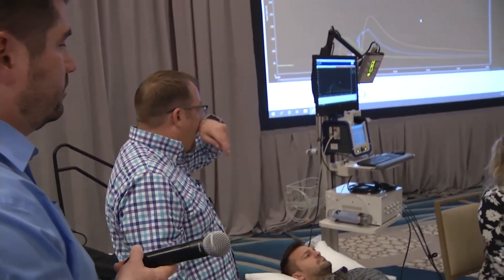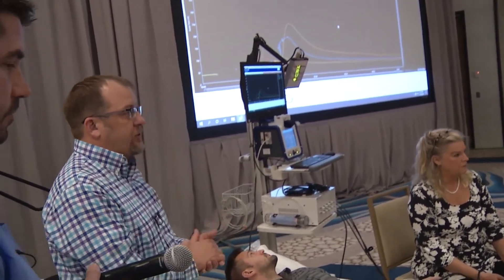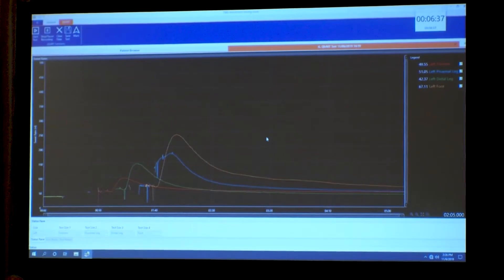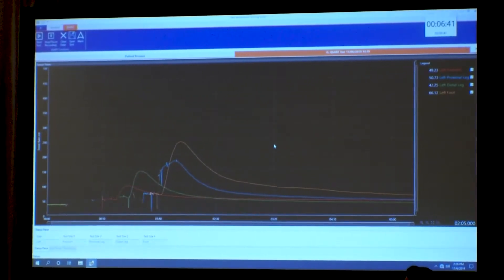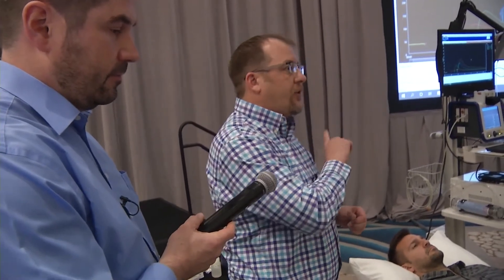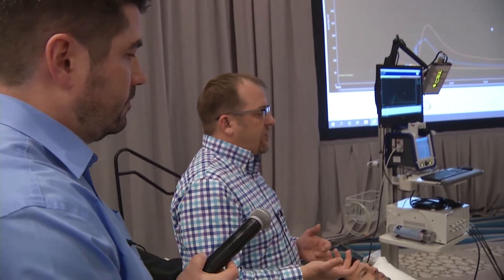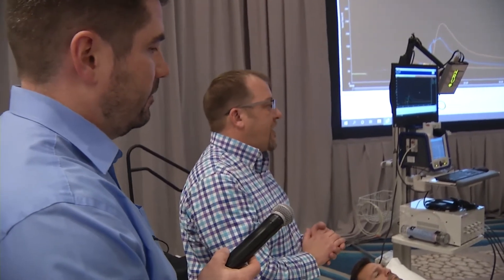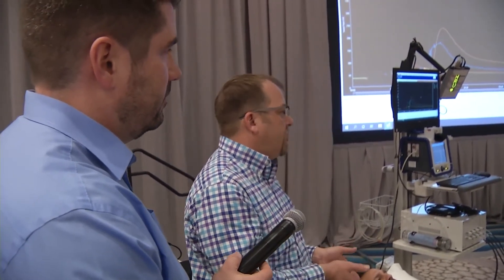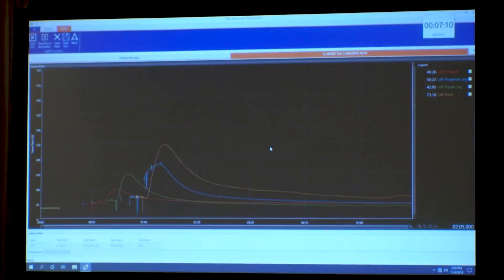We're waiting for the screen lines to come to a baseline, which shows the amount of moisture coming off the skin without stimulation. One difference we use at Mayo Clinic is putting a mark in when we actually go to inject the acetylcholine solution into the capsules. This tells us if there's a leak during that time period — whether it's due to the acetylcholine being injected rather than the stimulus that's about to start.